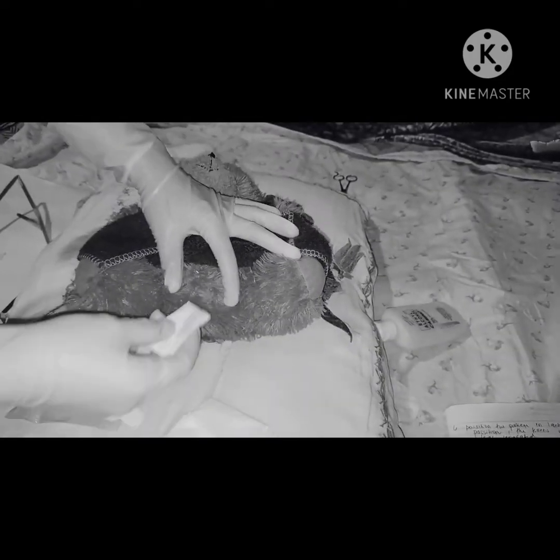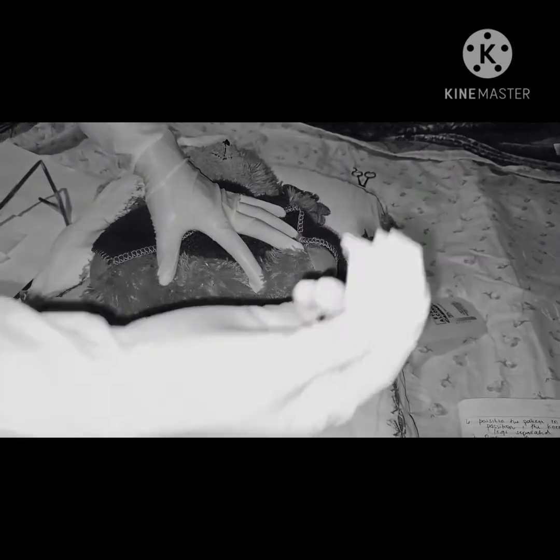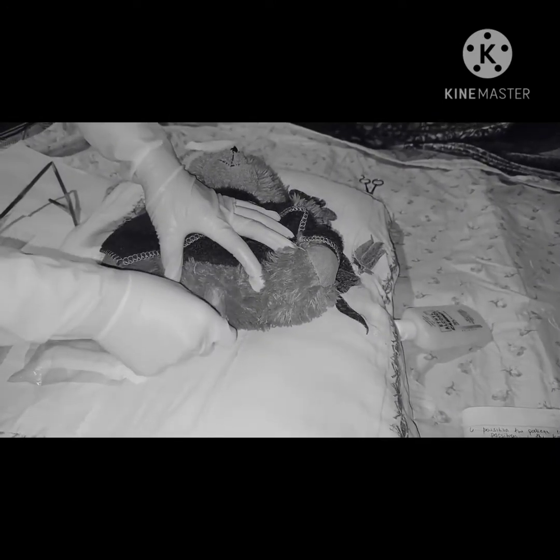I am going to cleanse from the clitoris to the anus, from top to bottom, 3 times. After using this towelette, I discard it. The second one, from top to bottom, from clitoris to anus, and discard. And the third one, from top to bottom again. Well, it's done.